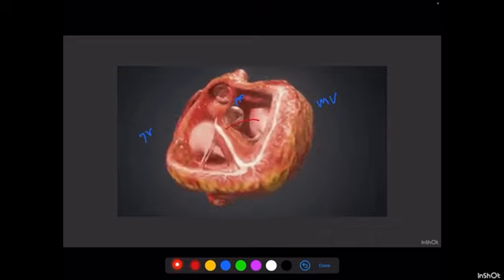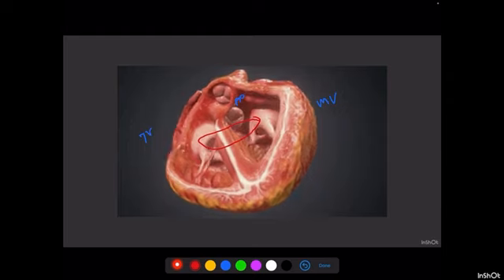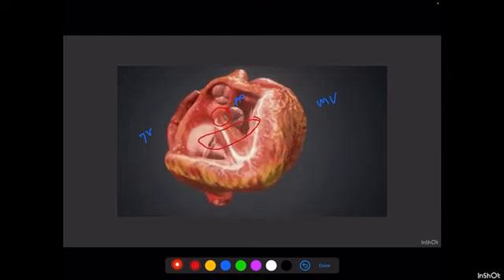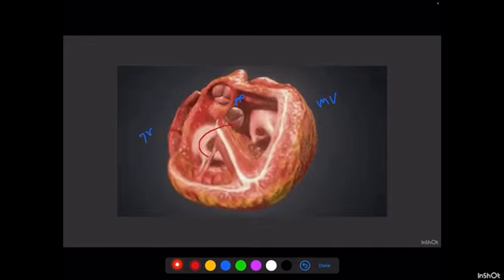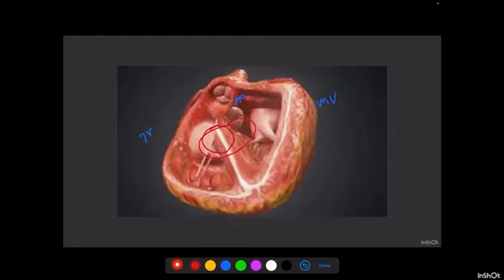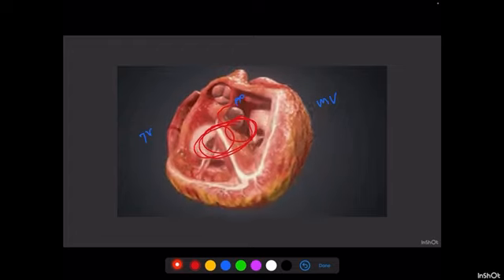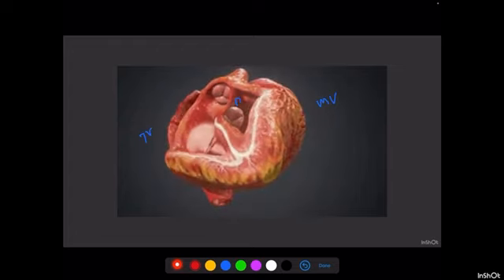If you have only one valve, the aorta will not have place to sit in between them. So it will be pushed anteriorly. You might either have one ring or two rings within the one valve. So the aorta will still be anterior.